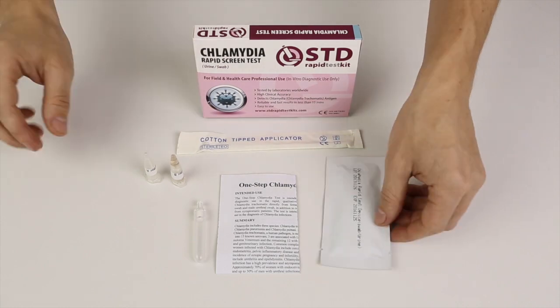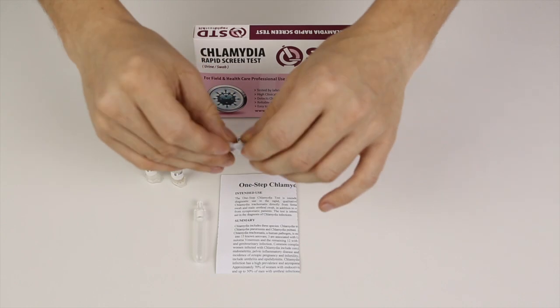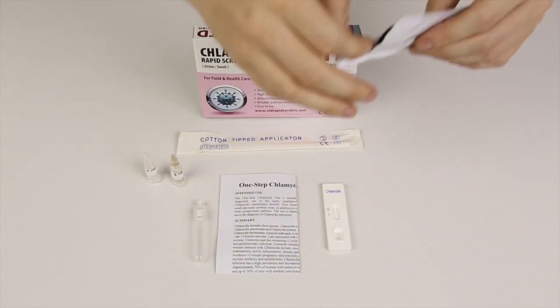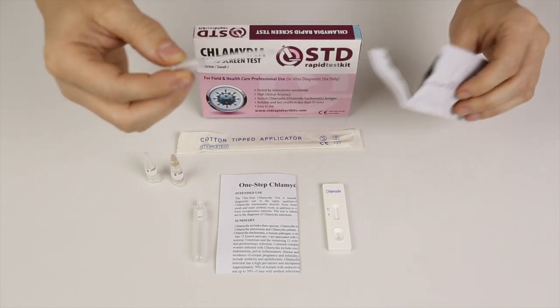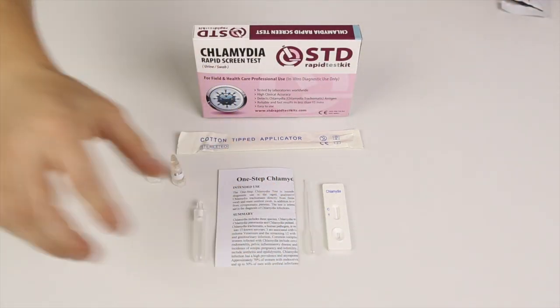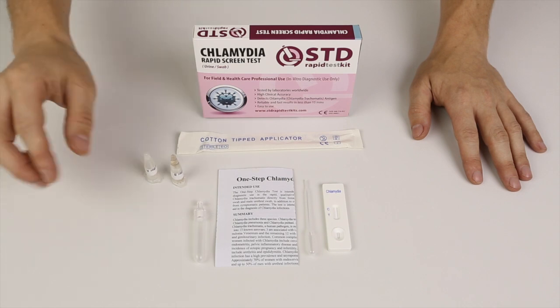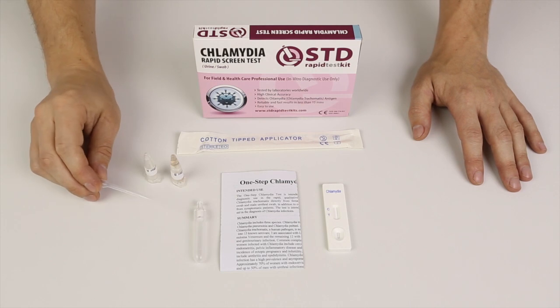I'll proceed by going through the test kit setup. The pouch — tear to open like this and take the cassette out. Actually, there's one more part: inside the pouch you will also find the dropper that looks like this. That's the one you'll use to draw liquid out of buffer A and buffer B, and that in turn goes into the central well.